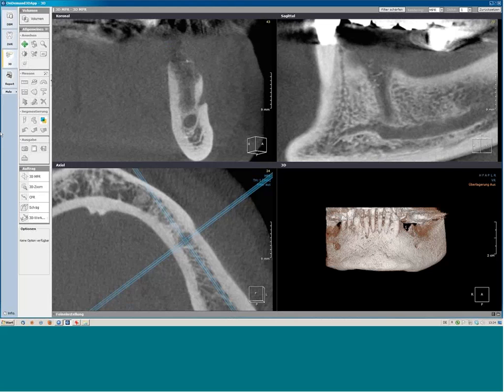Okay, here we see a situation some weeks after extraction, and you can see exactly the second premolar which was extracted, and you can see a very thin, light grayish line of new bone here. Here again, you can see that in the innermost part of the root socket. We have to think about whether there is no bone, but it might be.